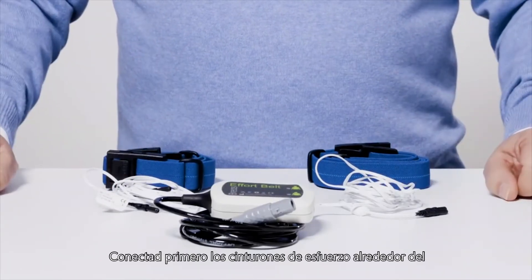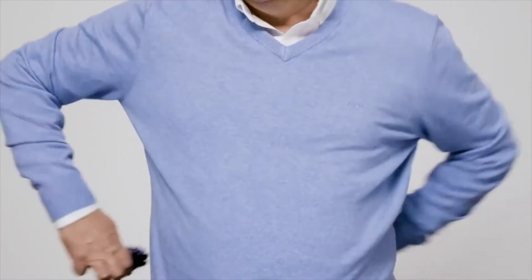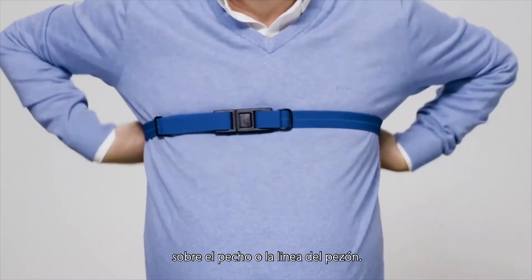First, connect the effort belts around the thorax and abdomen of the patient. To do so, put the thoracic or chest belt above the chest or nipple line.